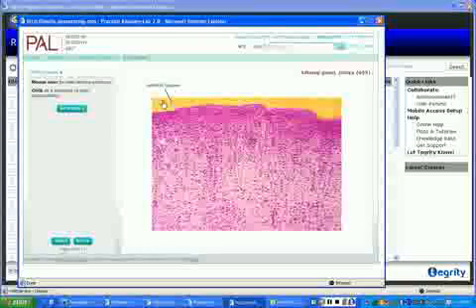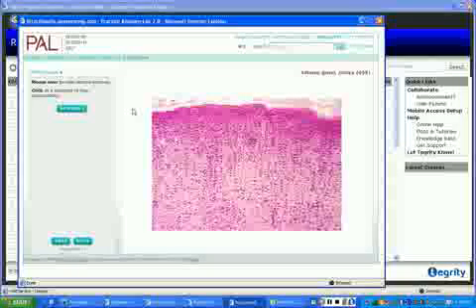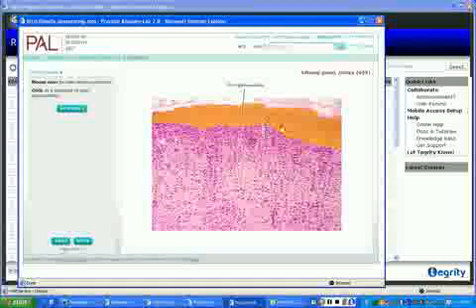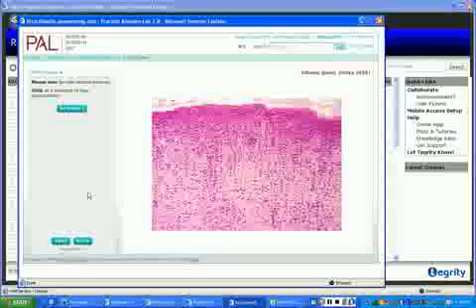Capsule. Outside of the capsule would be adipose, which you can actually see a little embedded in there, can't you? Ours, we know it's separate. Look, zona glomerulosa. Look here, zona. And they did like me. They say the other layers are so bad we can't see them. Let's not show them. Right? Ain't that how we did it? They're so smart.